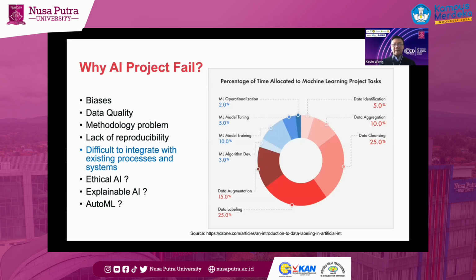A lot of the time in deep learning, they can say that in this area the probability of having a cancer cell is, let's say, 95%. And then when a human pathologist comes back and asks, how do you know it, right? It's very difficult to come up with a distinct answer for that. All right, so these are some of the problems that we are still continuously trying to work through and explore ways to improve.